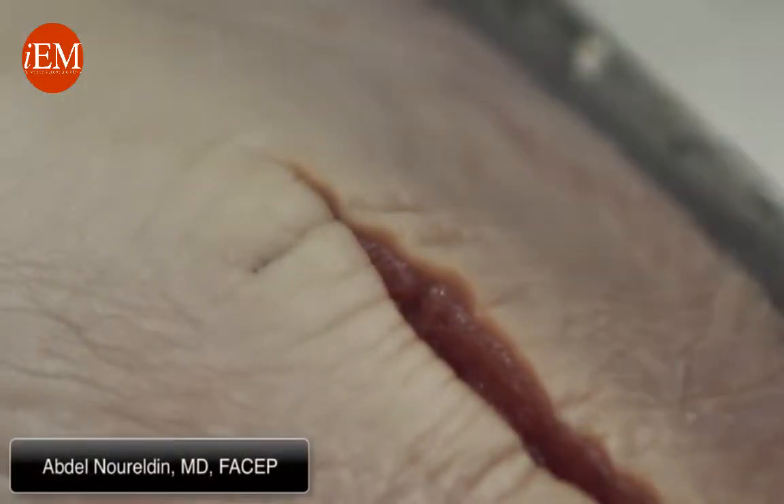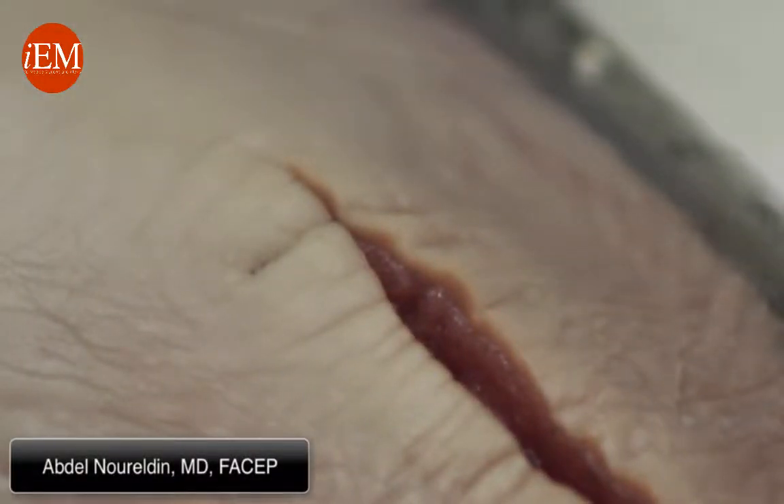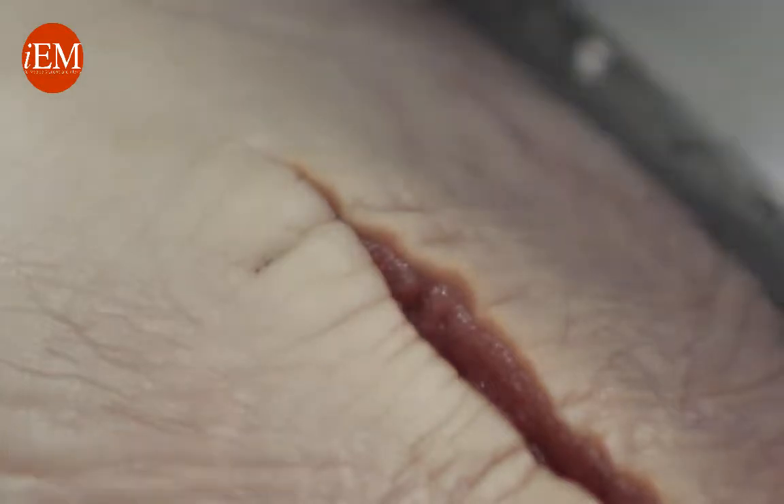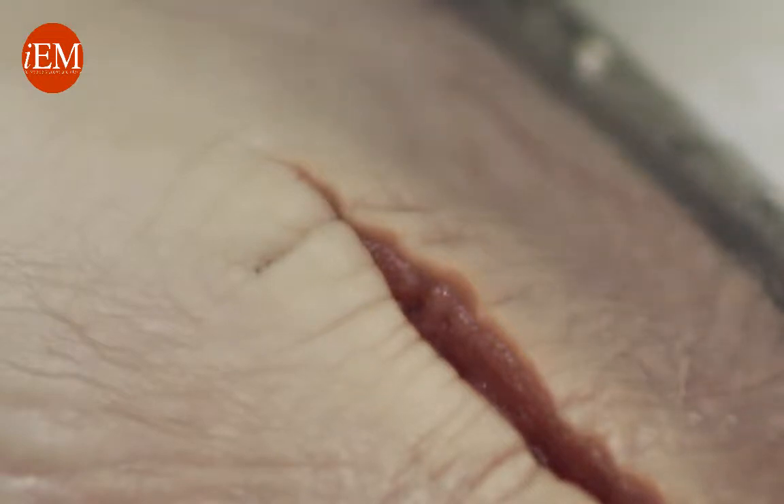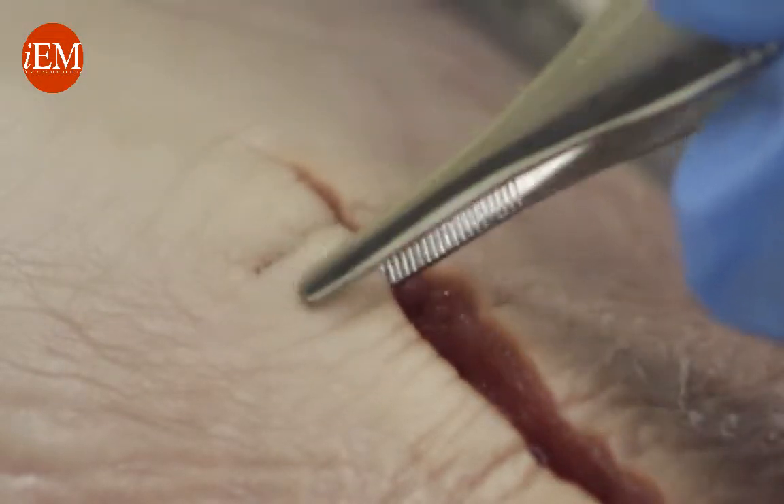We're going to show you how to do the vertical mattress. Your needle holder and your forceps — your pickup — should be used as a fork and knife. We grab the one edge again.